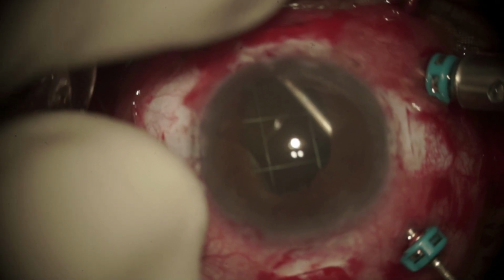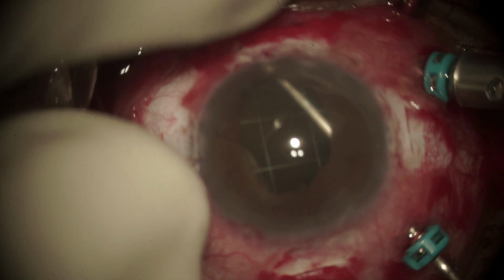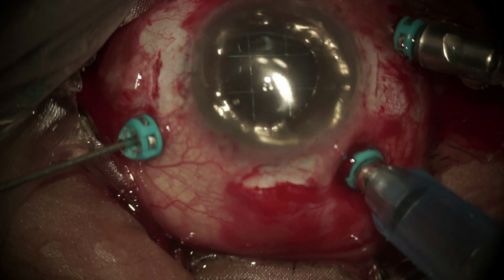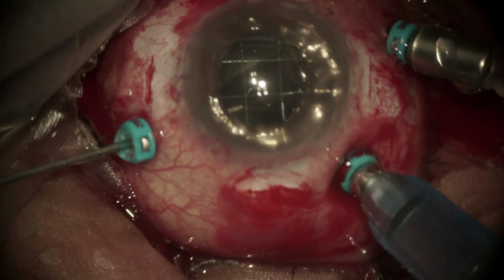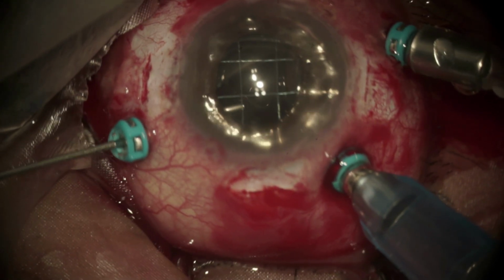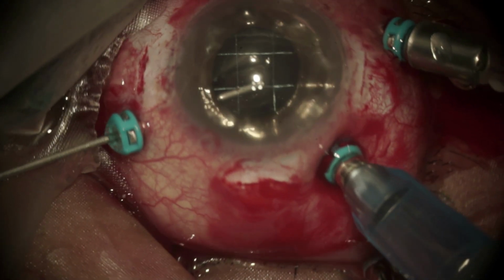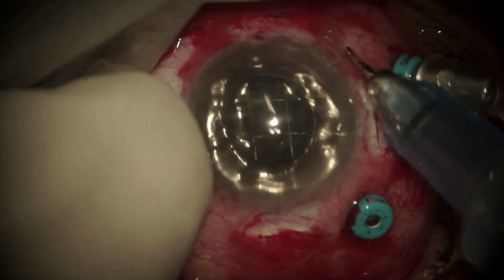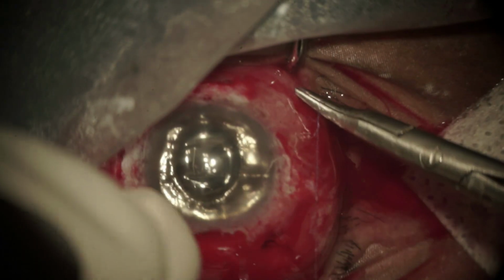Inferior peripheral iridotomy is done at 6 o'clock with the help of a cutter. Fluid air exchange is done. 5000 centistoke oil is injected. The flute is used to remove the residual air bubble and the silicone oil is filled up to the level of the sutures. The ports are removed and sutured with 8-0 Vicryl.